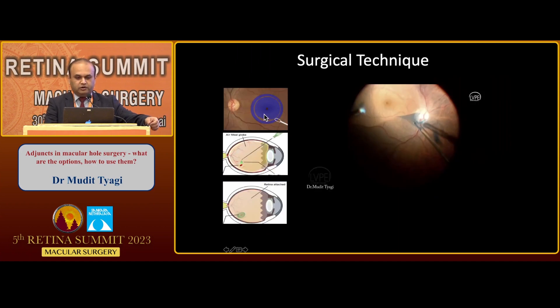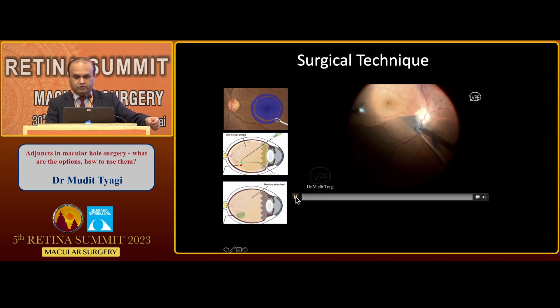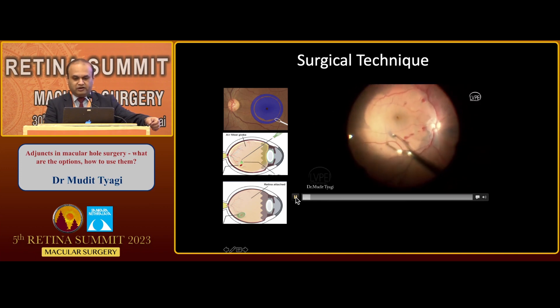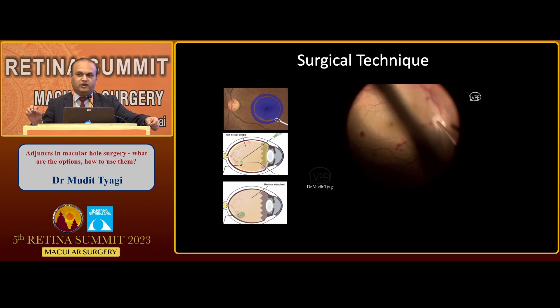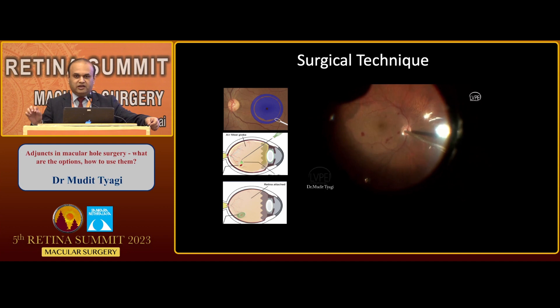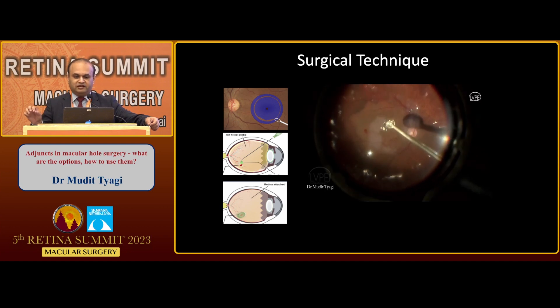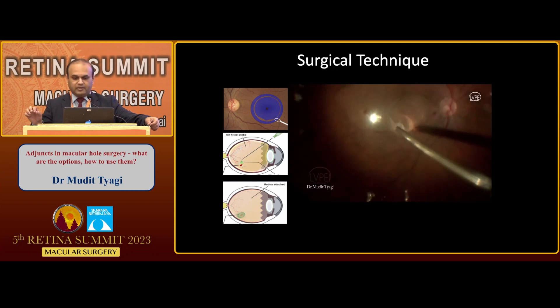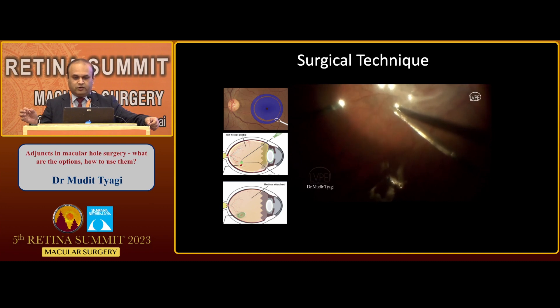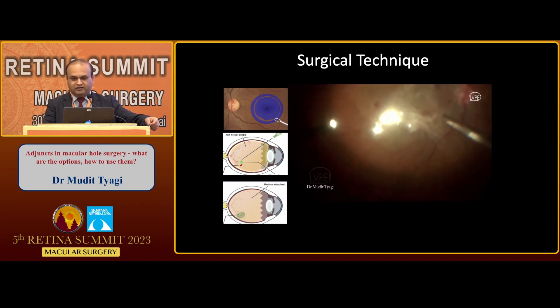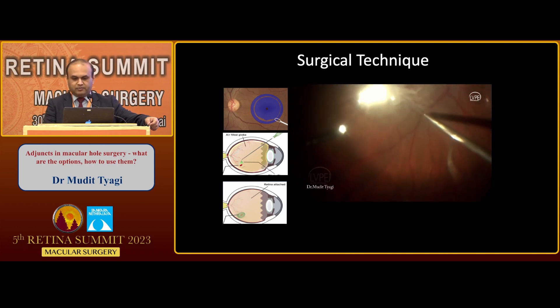The technique is simple: do an ILM peeling, and after that in an air-filled globe, just put a drop of fibrin glue to cover the break or the hole. Fibrin comes in two components — a thick one and a thin one. The idea is to put the thick component first and then just one drop of the thin component. You wait two to three minutes and a thick coagulum gets formed. This coagulum can be lifted and deposited. We completed the fluid-air exchange again to ensure the entire area is completely dry, then placed and deposited the coagulum to cover the macular hole.